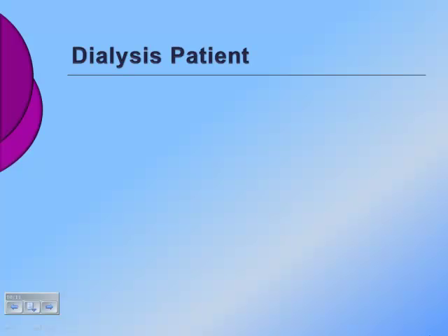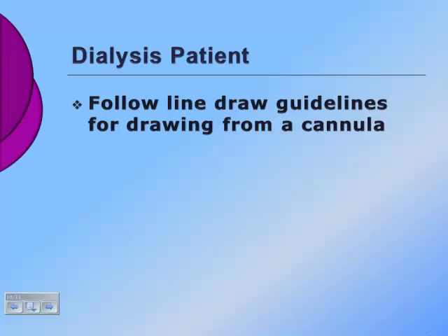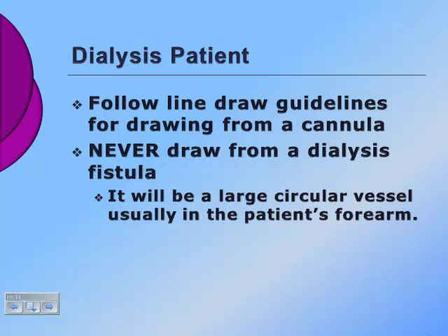Dialysis patients present problems in drawing them. If you are drawing them from a cannula, you will need to follow line draw guidelines. The nursing staff should have to do this for you. You should never draw from the dialysis fistula. You'll be able to tell it's a large circular vessel, usually in the patient's forearm. There are some patients whose graft has grown shut and you can use it, but you should always check with the nursing staff before doing this.